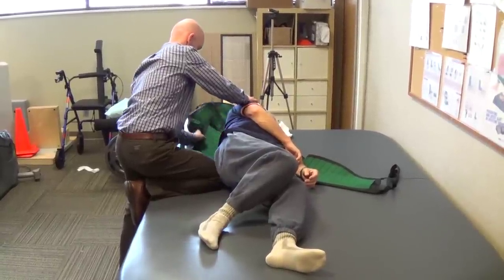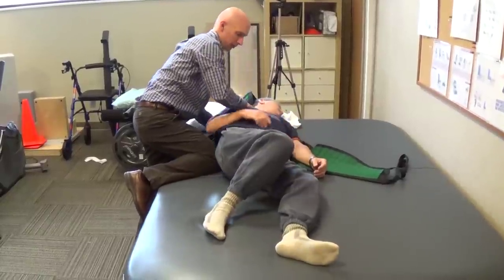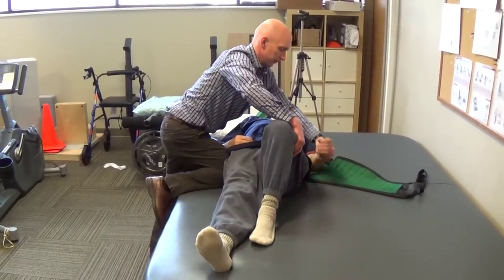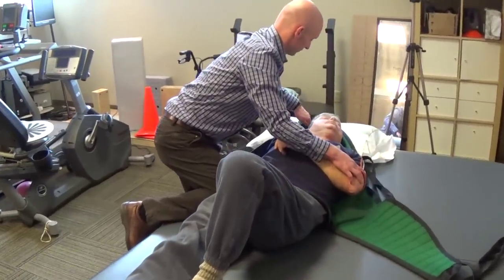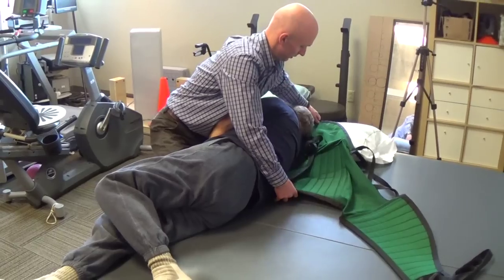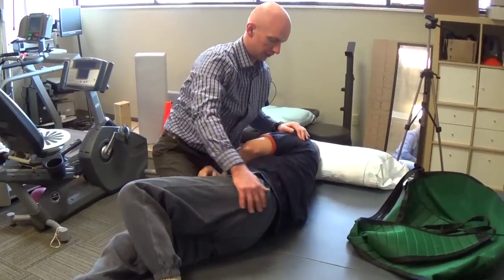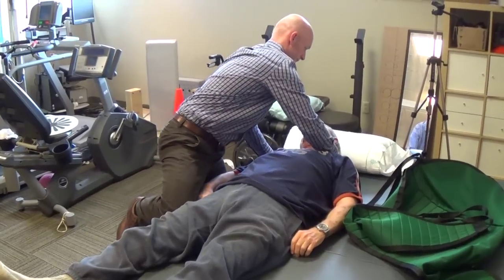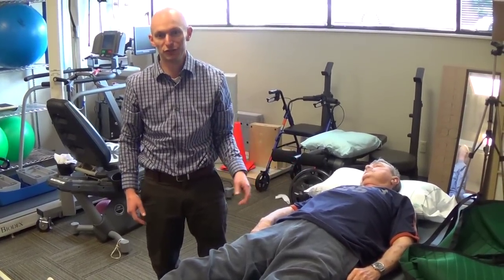Folding the sling up in half. And then assisting the person to roll back to the other side. Taking care not to pull on their arm, moving their head to the other side. And then pulling out the sling. And then assisting them to lay back in the middle of the bed. And that's how to use a hydraulic patient lifter to transfer a person to the bed.